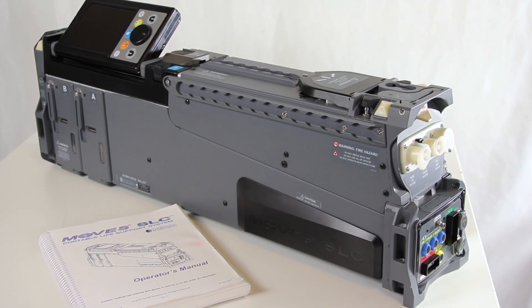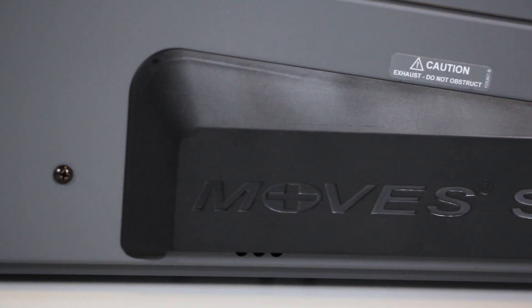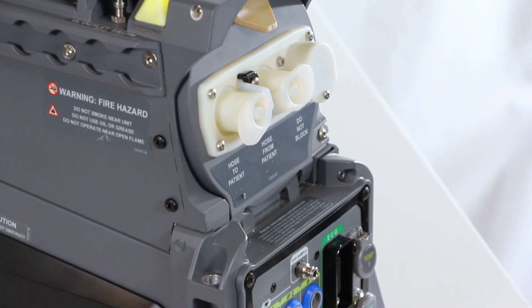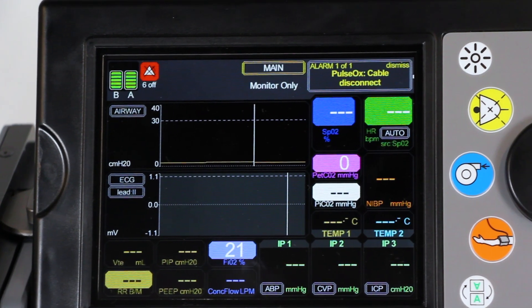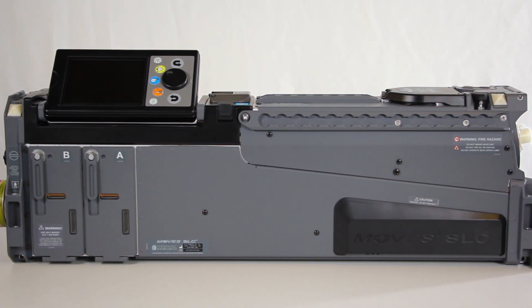Welcome to the MOVES SLC user training video. MOVES SLC is a revolutionary, completely integrated intensive care unit, combining an oxygen concentrator, circle circuit ventilator, suction system, and complete vital signs monitoring into a single, compact, portable, battery-operated system.